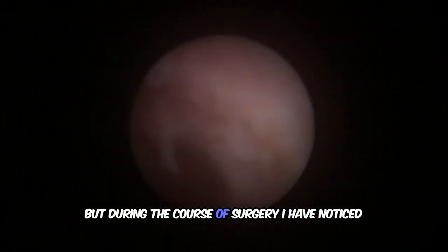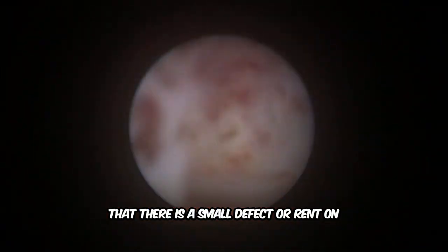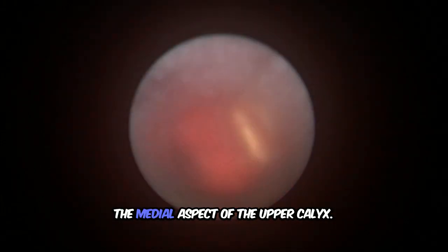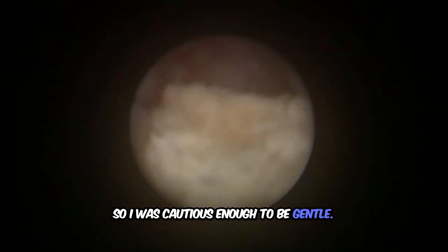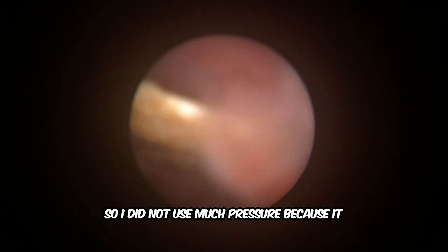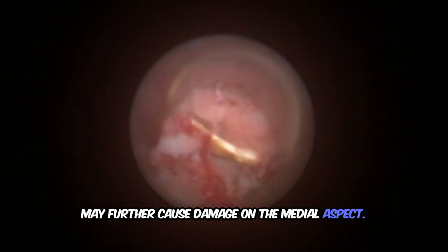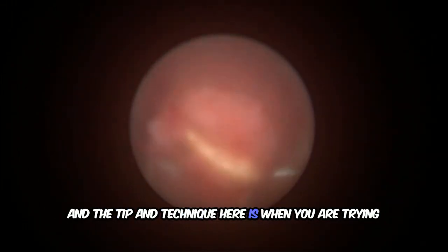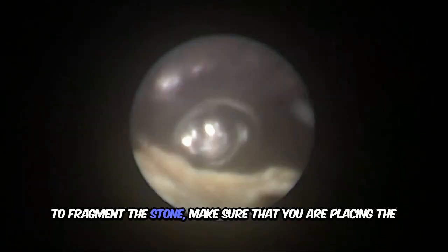But during the course of surgery, I noticed that there is a small defect or rent on the medial aspect of the upper calyx. So I was cautious enough to be gentle. I did not use much pressure because it may further cause damage on the medial aspect. And the tip and technique here is, when you are trying to fragment the stone, make sure that you are placing the stone elsewhere so as not to make further injury.